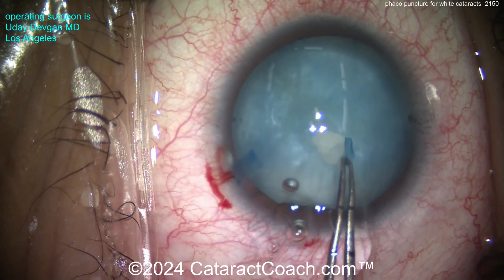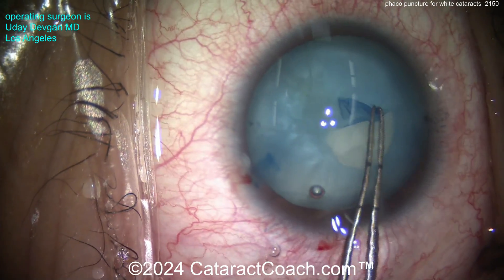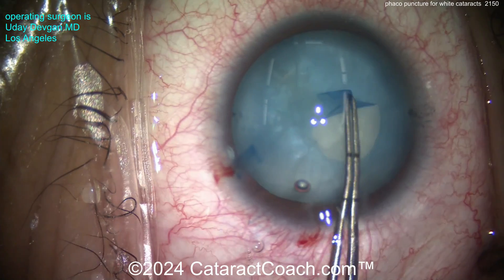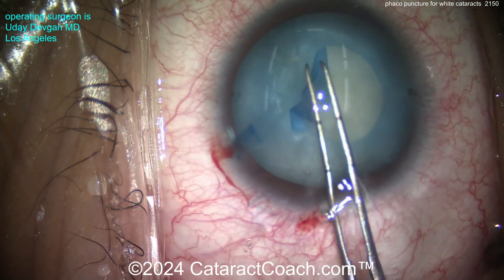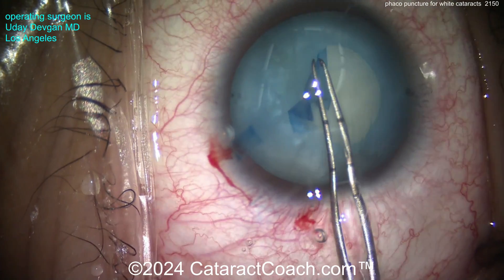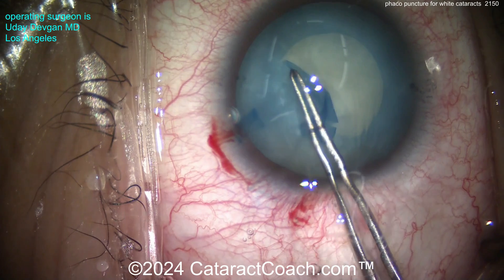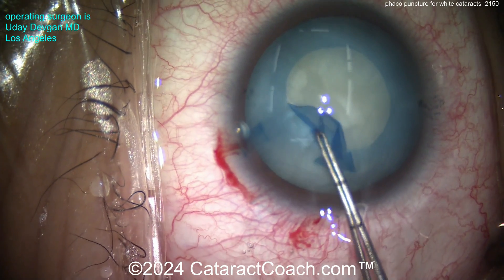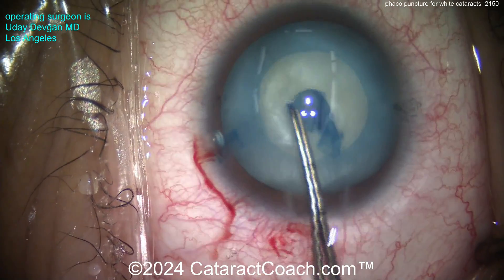The bag is now decompressed, and we can create a normal rhexis. I'm using forceps to create a nice beautiful rhexis. Going slow — if I notice it wants to run out, I'd quickly drag it to the center and complete a round or even irregular rhexis, as long as it's intact. Luckily it's decompressed enough to complete a beautiful rhexis.